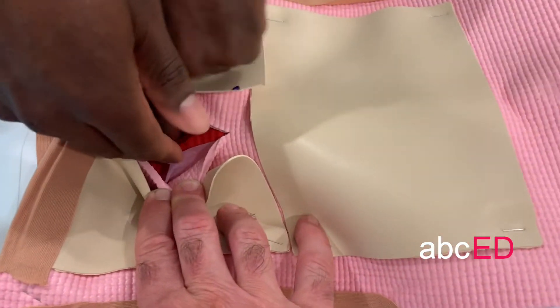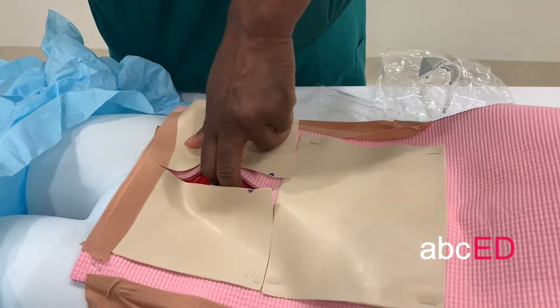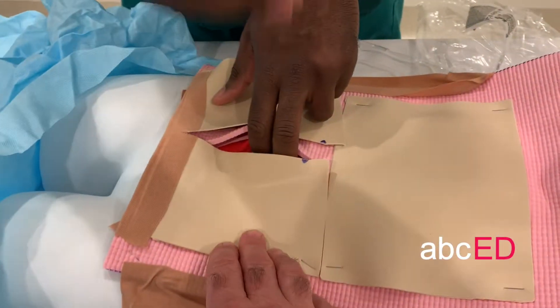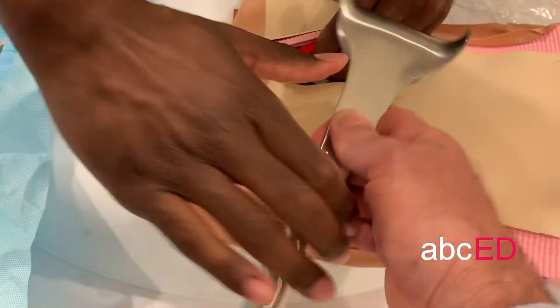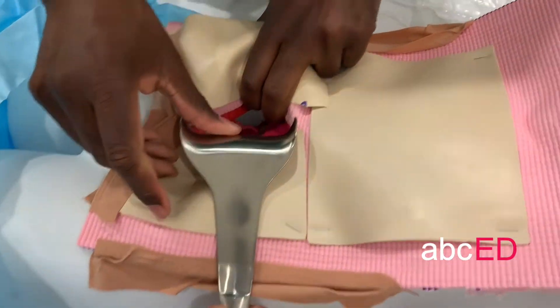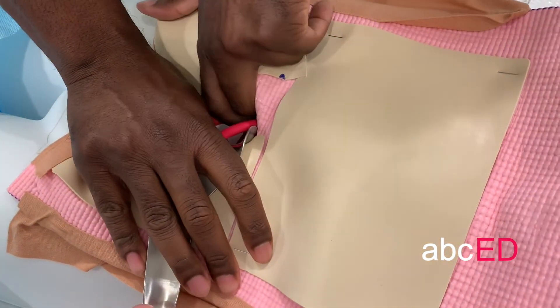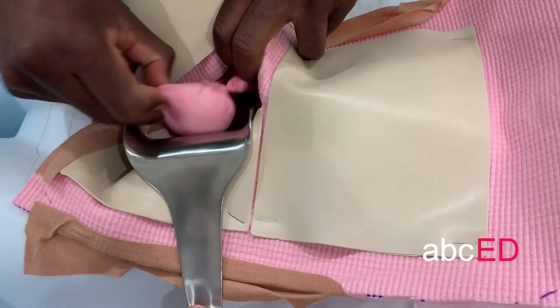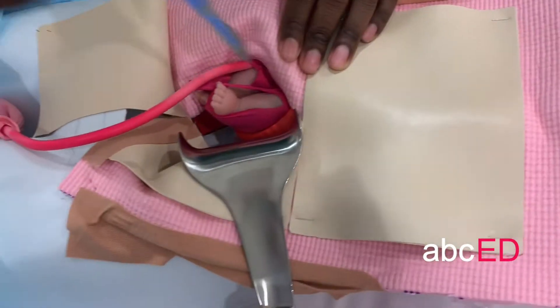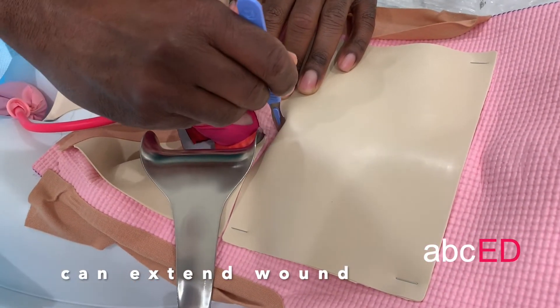At this point you want to get your hand in there, and ideally you want to identify the head. As with any procedure, if you've got big hands and you're finding it a struggle to get in, either you can get someone to use a retractor to hold things, or ideally you don't want to pull the baby out by just the presenting part and potentially cause damage to the baby or placenta. If you're struggling, you can always extend your incision.